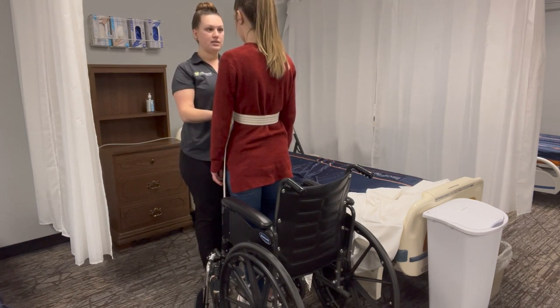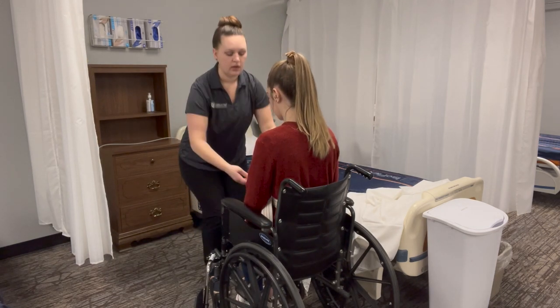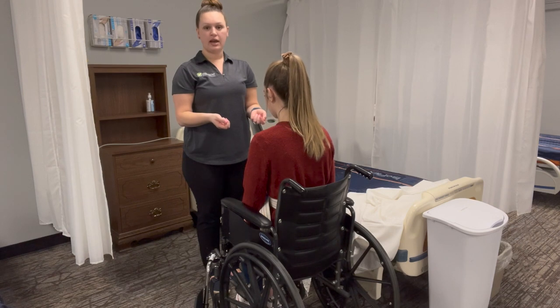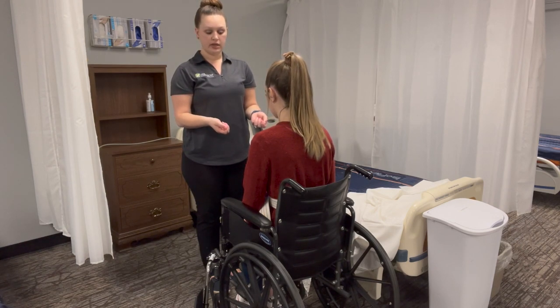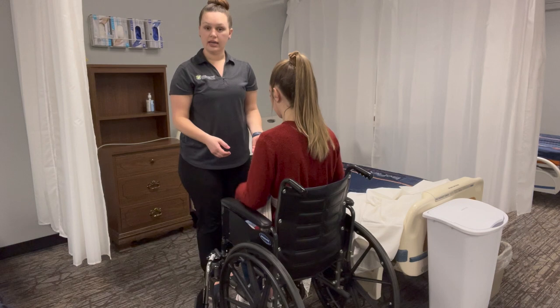Allison, we're going to sit down on the count of three. One, two, three. While we transferred Allison, I was holding on to the gait belt for safety the entire time. With her in the chair, we're going to make sure her hips are all the way back. We're going to remove her gait belt.